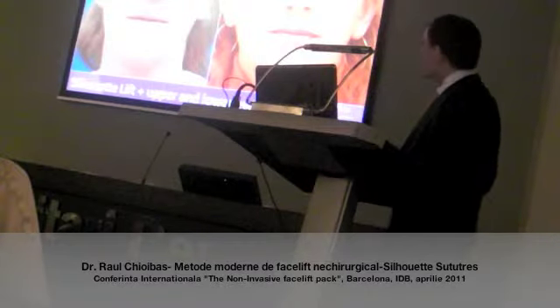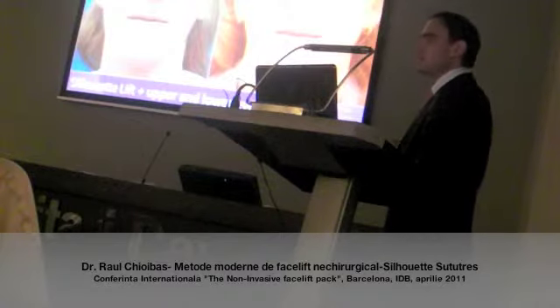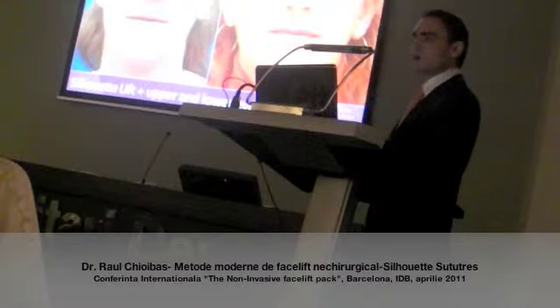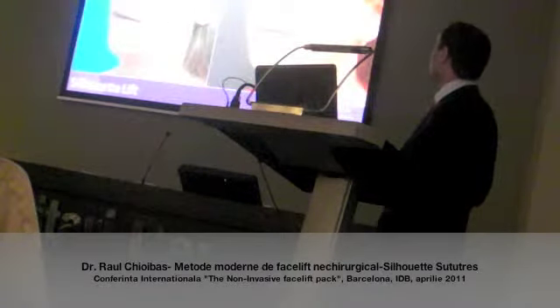You see, again, after one month, because of the edema, everything is nice. But after 4 months, the edema is gone, and we have this hollowness of the upper eyelid.